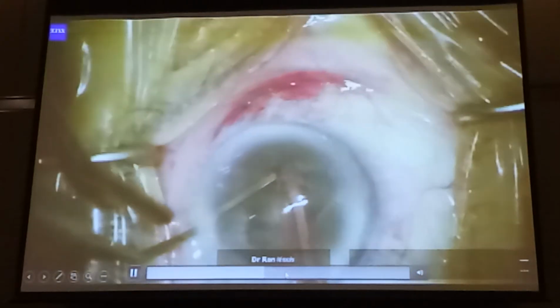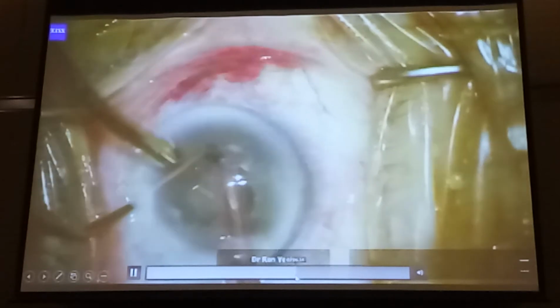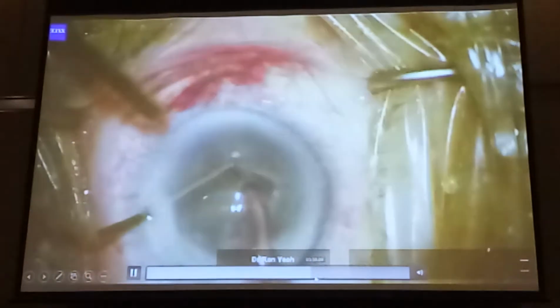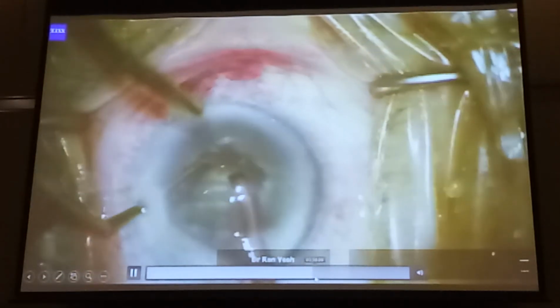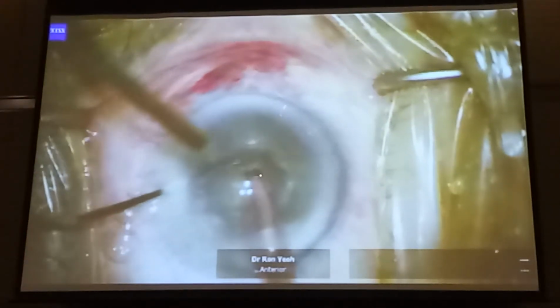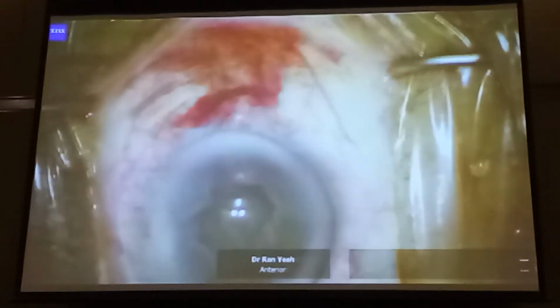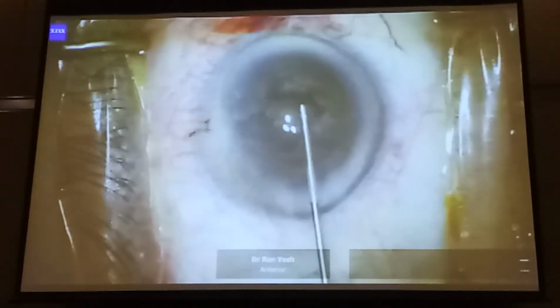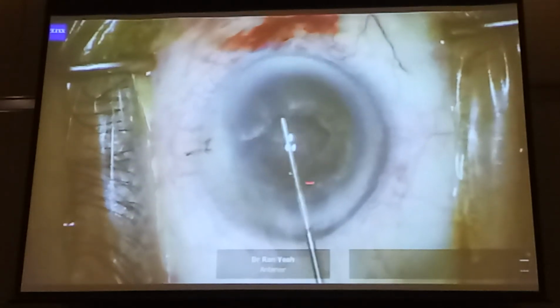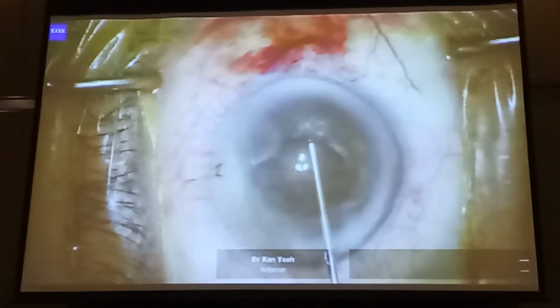So when it's become like this, what do you do? At some stage she decides she's had enough and says, would I take over and help her finish this case. Now you've got a bit of a crater there, and it's a little bit like what Sri showed just now, but then you've got nothing to grip, very hard to proceed with this, so she comes back and says, here, you do it instead. And so I go in and I have a look and say, oh gee, okay, that's not a nice situation. Soft cataract, big bowl in the middle, nothing very recognizable in here.